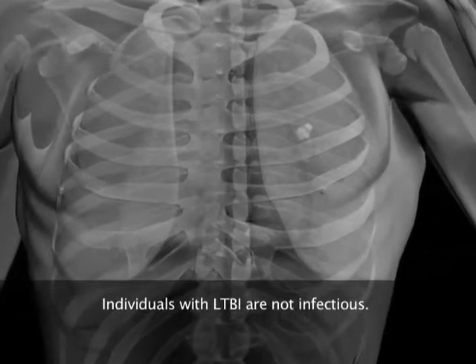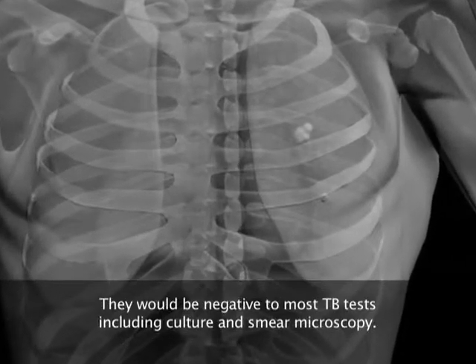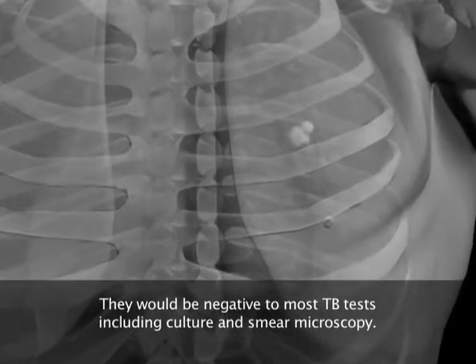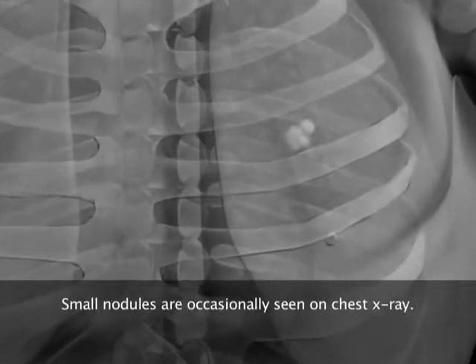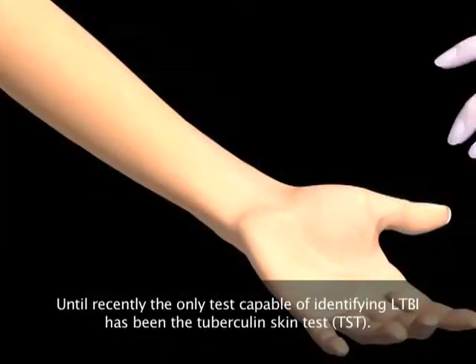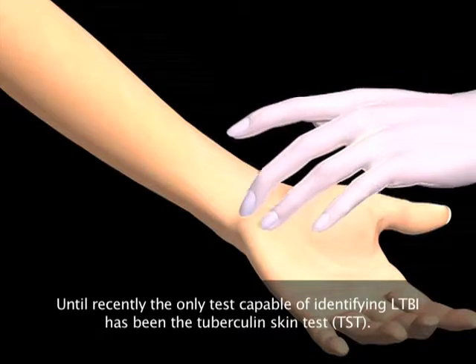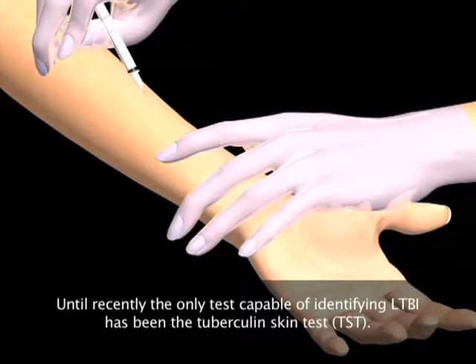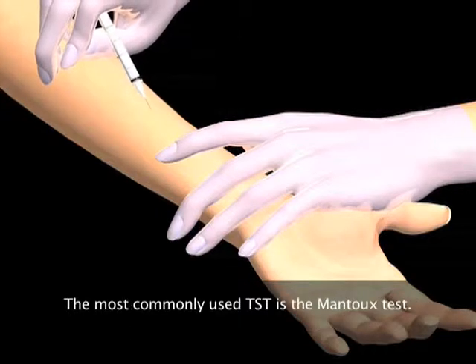Individuals with LTBI are not infectious. They would be negative to most TB tests, including culture and smear microscopy. Small nodules are occasionally seen on chest X-ray. Until recently, the only test capable of identifying LTBI has been the tuberculin skin test, TST. The most commonly used TST is the Mantoux test.